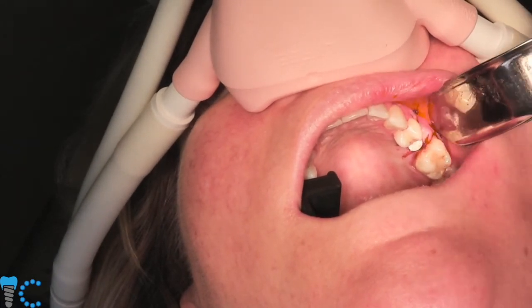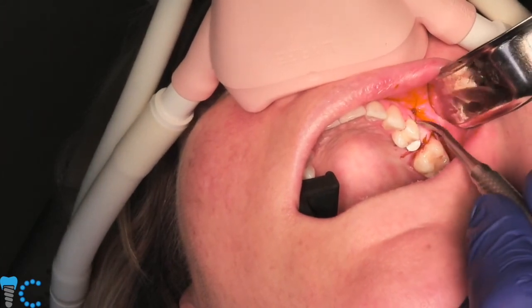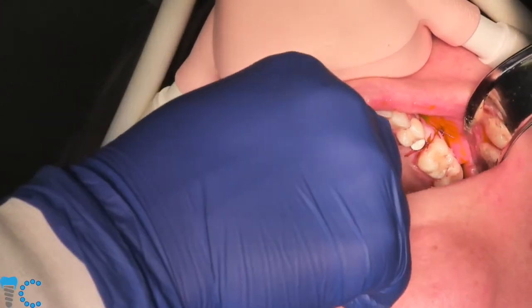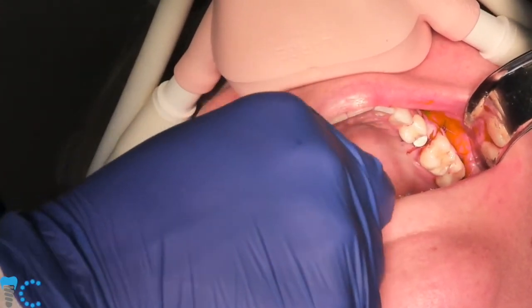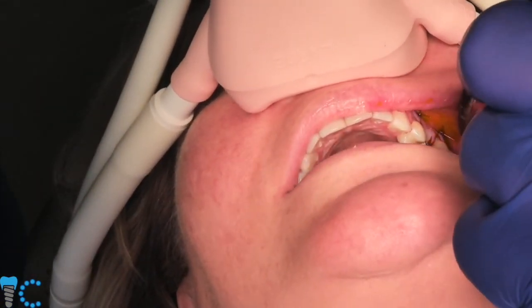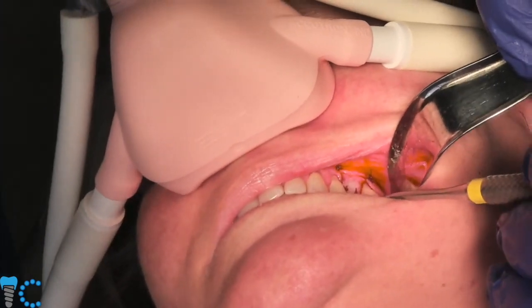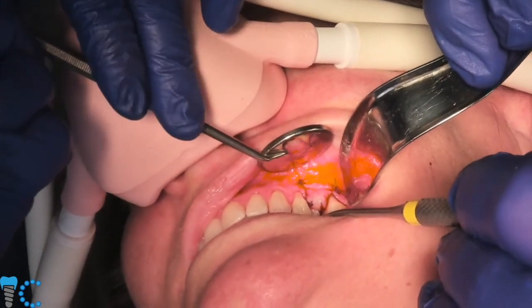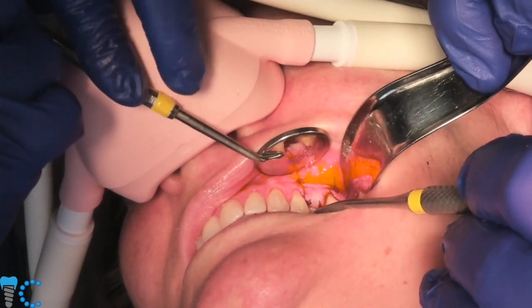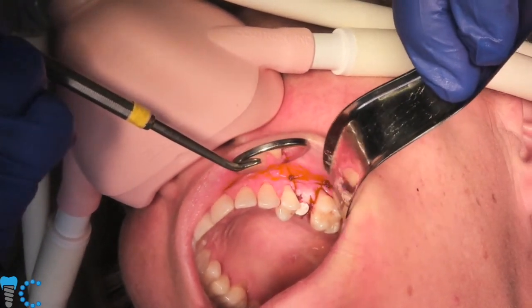This is a pretty nice result. She obviously has a little tissue recession on her adjacent teeth here, and we'll talk to her about not trying to brush the white off her teeth. So we'll have you close down one more time. And there's our final result. Can we see that? Open one more time. That's wonderful.